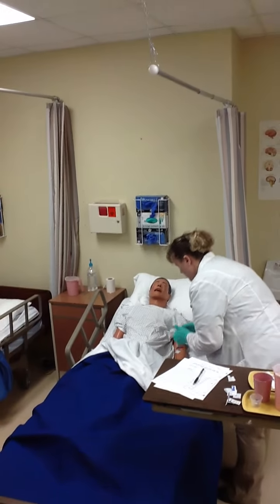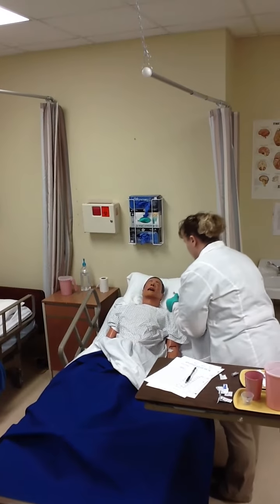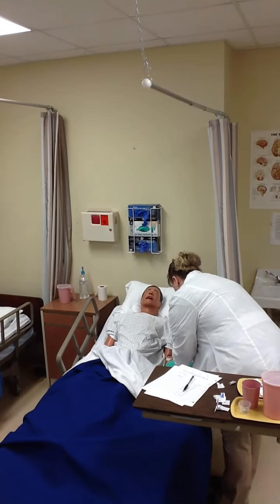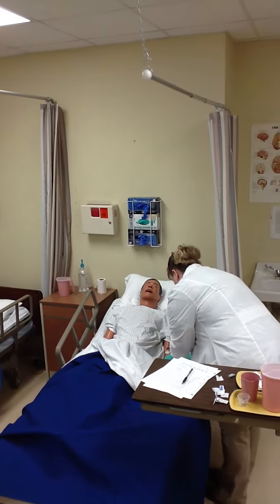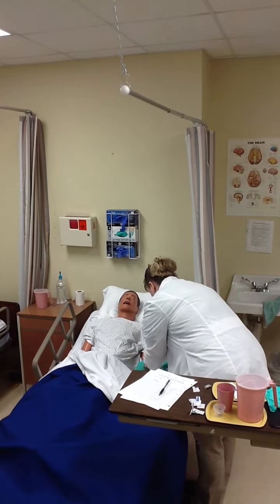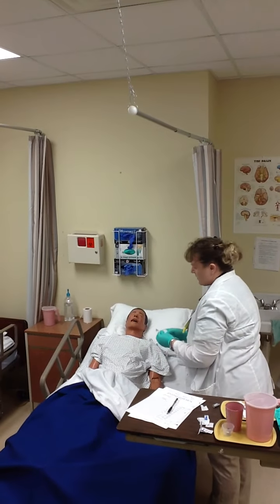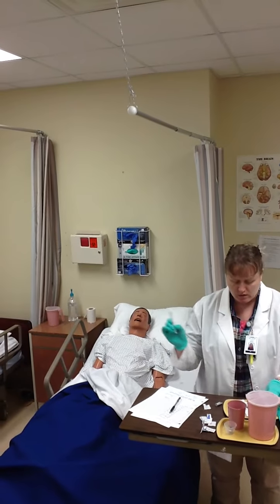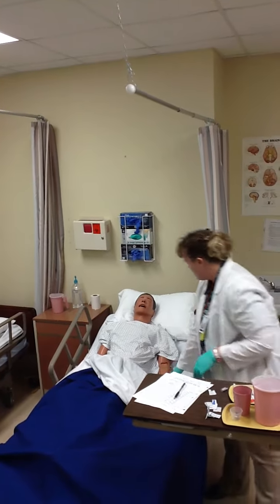Have that patient's forearm. I remove my cap and set it out of the way. And I'm going to go in just right underneath there. Make that small bleb. Once I've done so, I'm going to recap my needle. If the needles will not recap or have a safety feature, you want to make sure you take them immediately over to the sharps container.